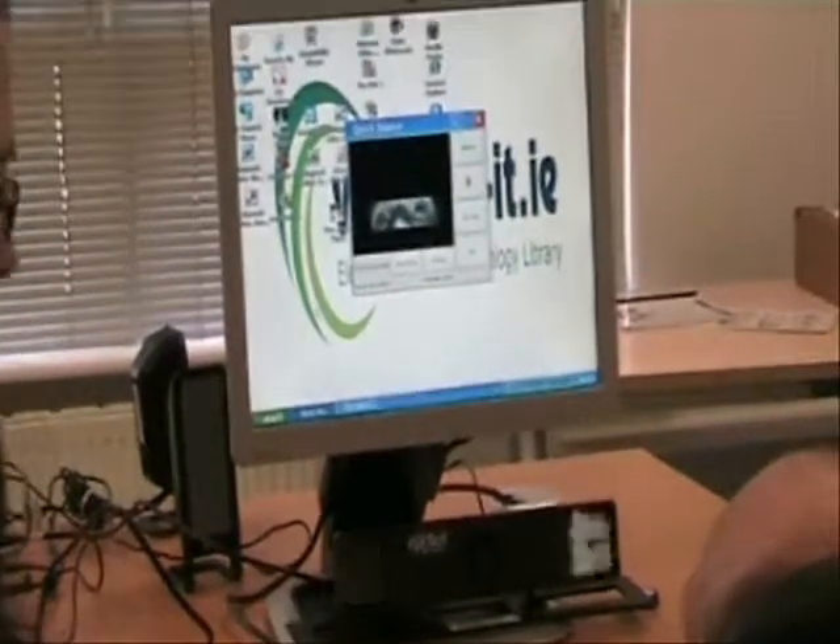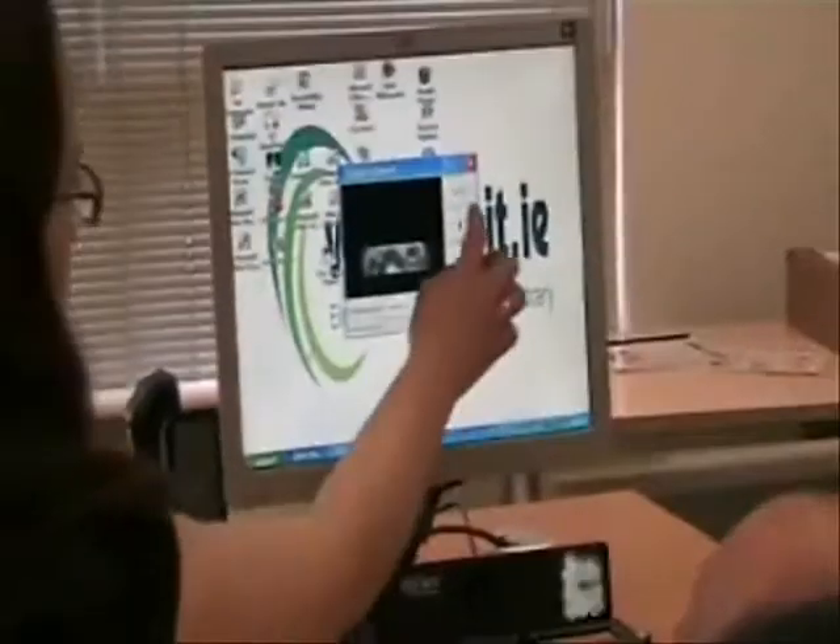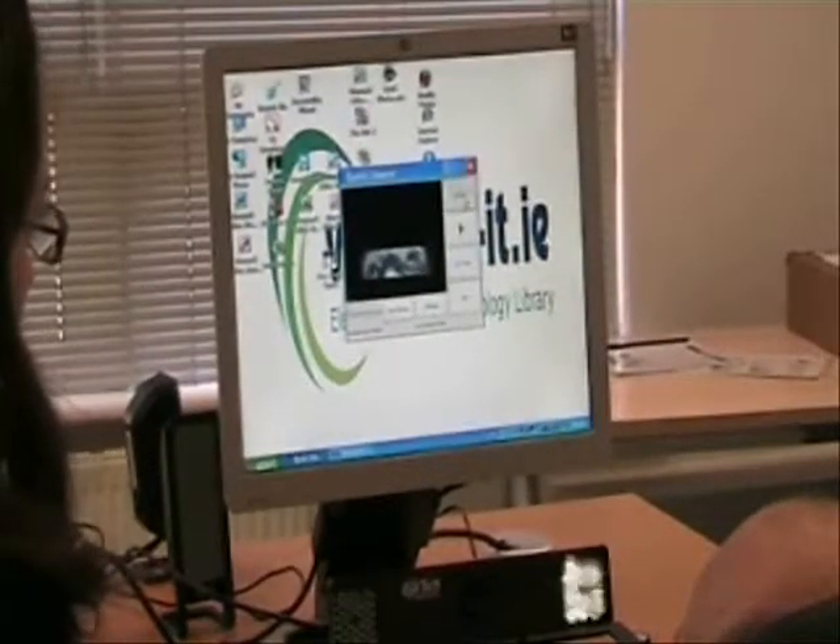Okay, the first thing we're going to do is calibrate again and just follow your eyes. So you're going to touch the calibrate button and just follow the dots around the screen.